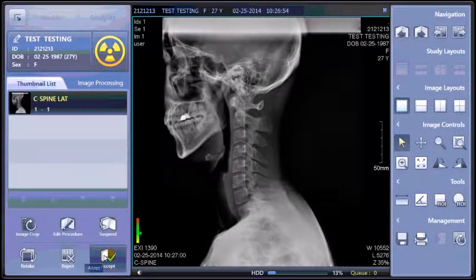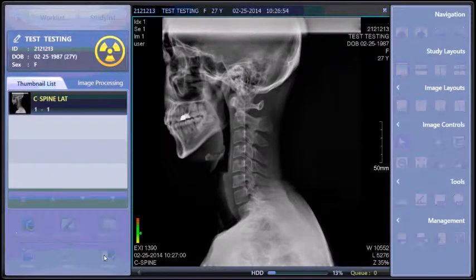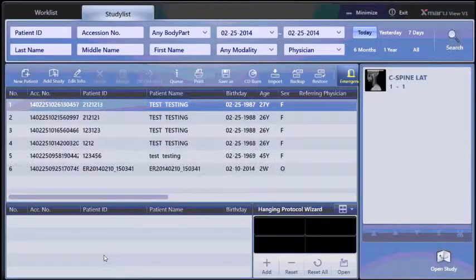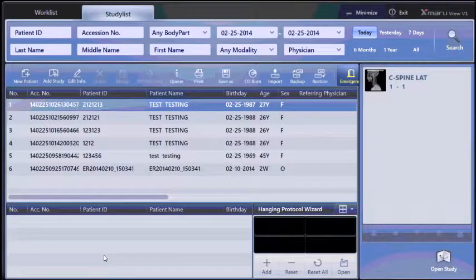When your study is complete, choose accept. This brings you back to the patient work list.